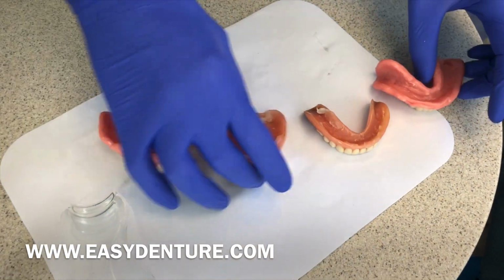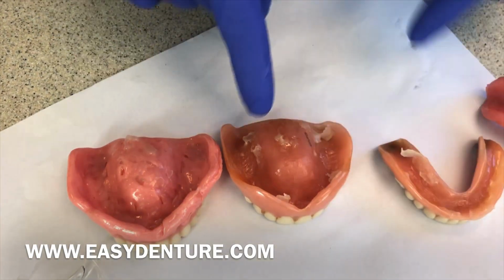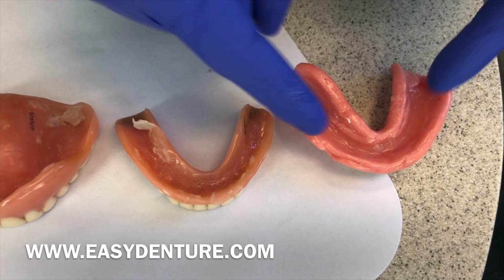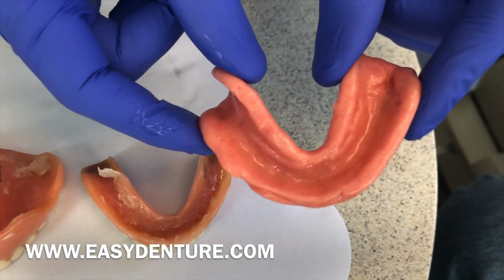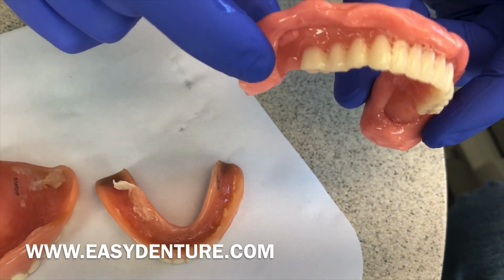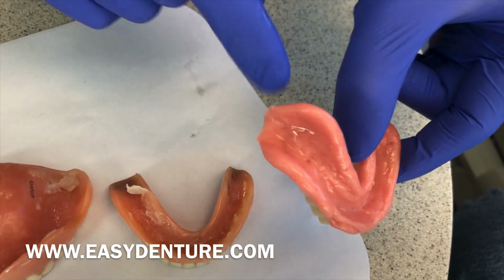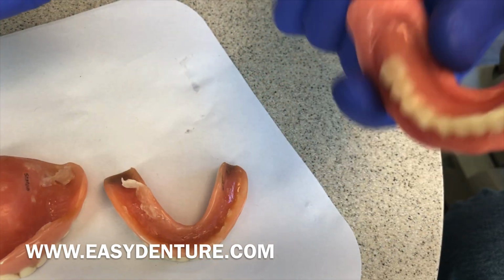Okay, so easy denture, his denture. You can see how much more of a vestibule of everything that we were able to capture. You could capture the undercuts with this because of the resilience of the material, so therefore you get some good retention. If I didn't want to have any of this material here, I could trim it back with acrylic burrs, I could trim it back with scissors, I could reheat it and pull it off.